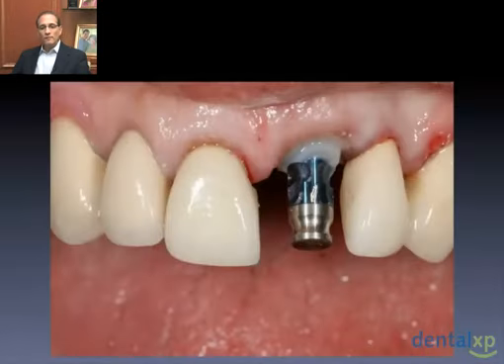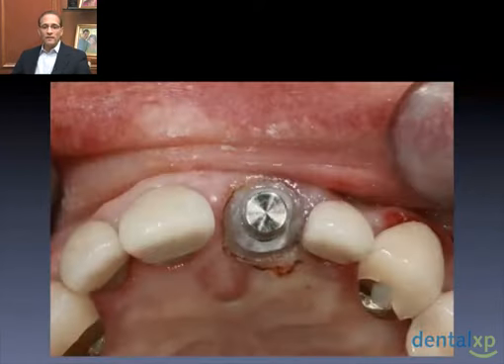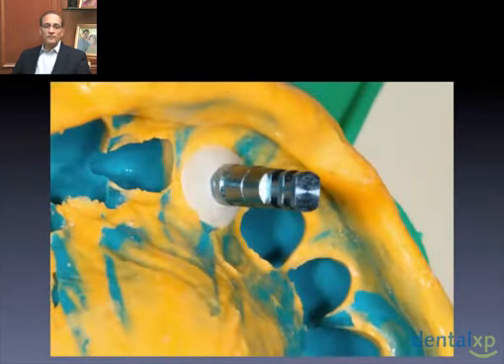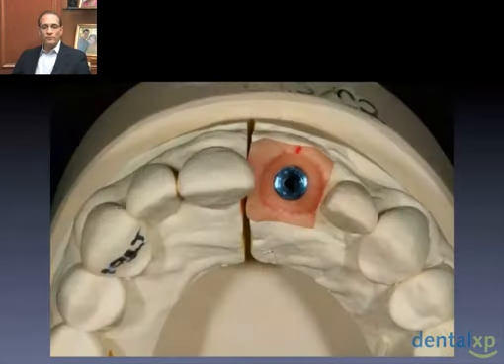I'm going to put it back in the mouth, and we'll prepare that composite collar that we created with the flow composite right in the mouth. We prepare this as if it is the free gingival margin, the margin on the crown, the margin on the abutment, where we want it to be. Now that it's prepared, my shoulder preparation, I can take an impression of this and send it just like this to the laboratory, capturing all the subgingival contours that the provisional has created.